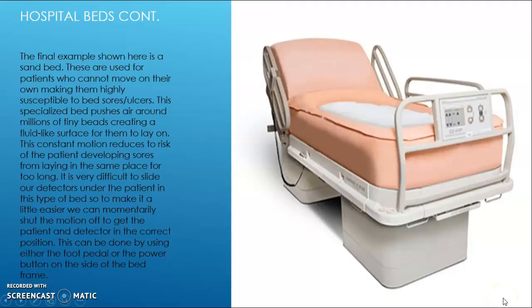And the last type is the sand bed, which can be tough to use, but they're very good for the patient. They're used for patients who cannot move on their own, making them highly susceptible to bed sores or ulcers. These specialized beds push air around millions of tiny beads, creating a fluid-like surface for them to lay on. This constant motion reduces the risk of the patient developing sores from lying in the same place for too long.